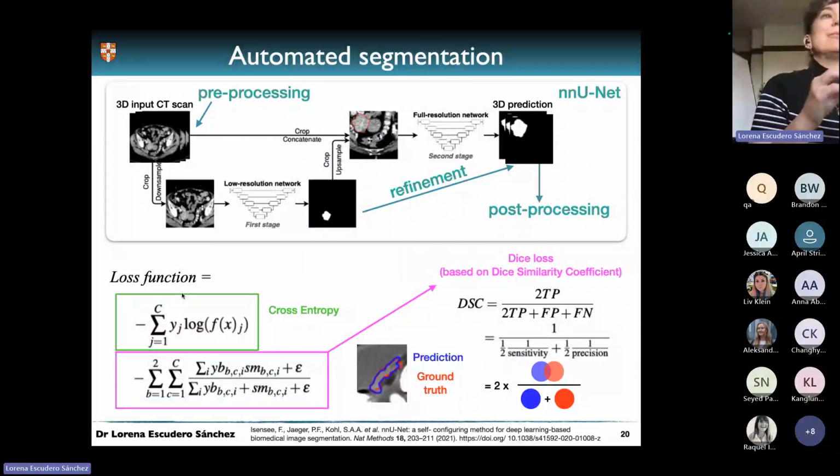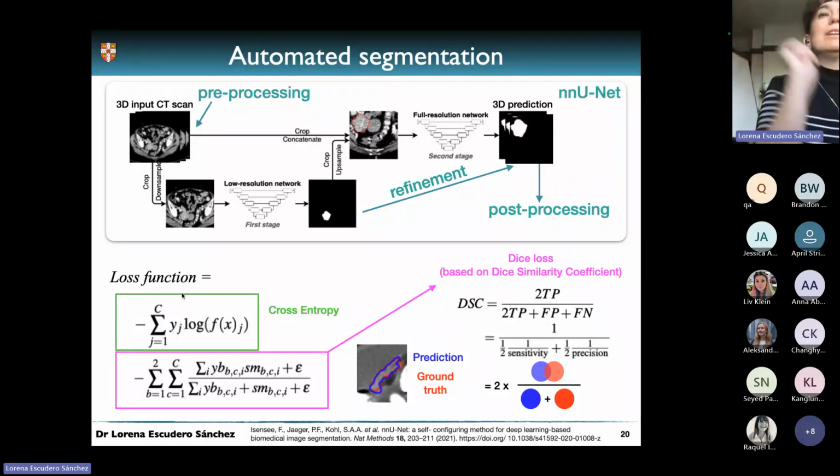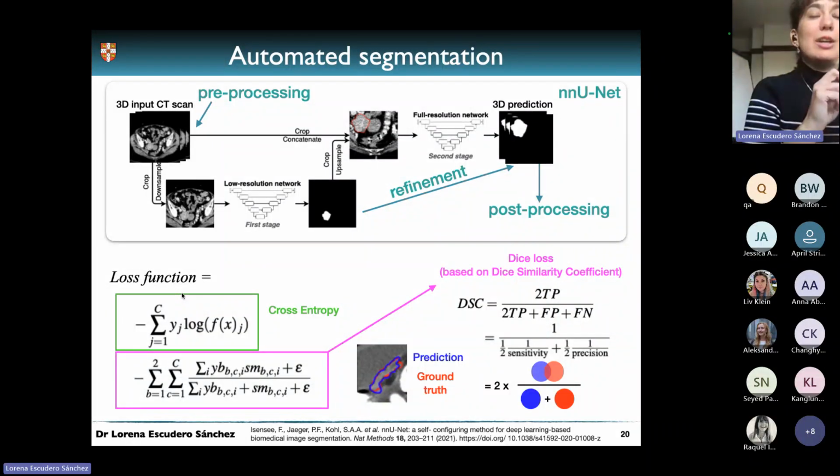And one of the things that made them able to differentiate the two were, for example, spikes or not very smooth contours around the delineations. Because, of course, if you do something manually, you're probably going to do it more smoothly than the algorithm, which can pick up things with a lot of detail, so it can end up having a lot of spikes. So those are things that we can incorporate into a post-processing stage and make our accuracy at the end, our dice score, better.